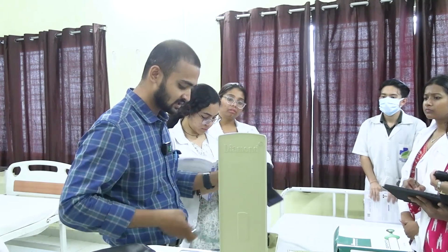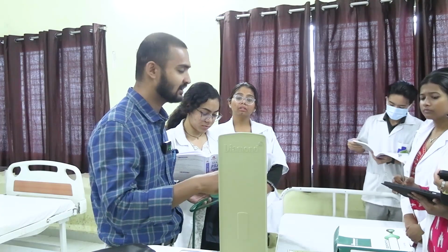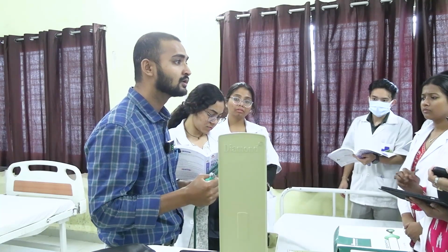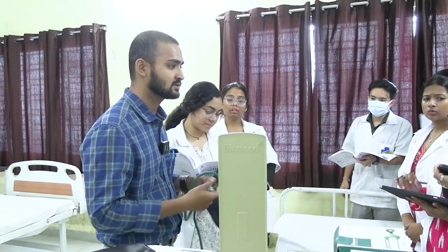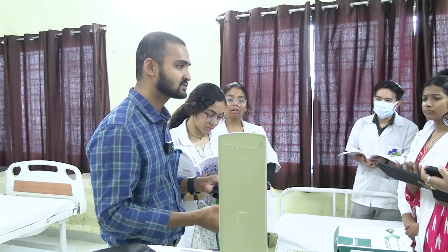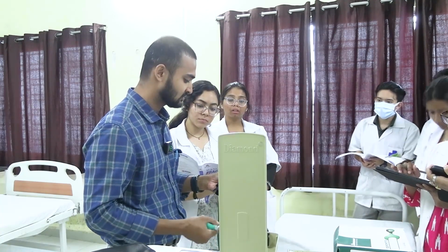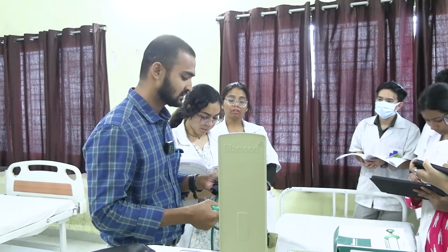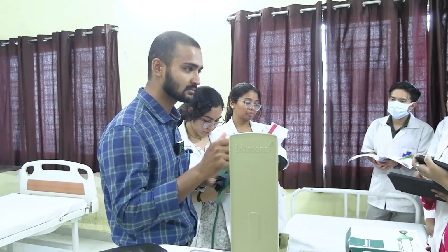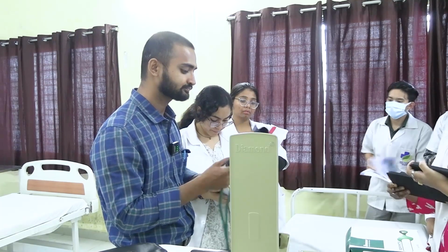Understood? There are two tubes. One is connected with the hand bulb, and this is the valve. This is used to lock the air pressure. When you are inflating it, you have to press it like this. If you lock it, it will get inflated but it won't deflate. When you release the valve, the pressure will decrease. This is the function of the valve. This is connected with the rubber bag, and then with this tube it is connected with the other tubing.